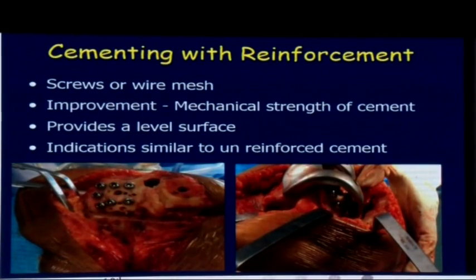You could cement with reinforcement, whether you use screws or a mesh, and you can see what has been done here. Several screw heads have been put to try and incorporate the cement. This is purely a temporary, and I put it to you, this is an emergency procedure because the surgeon hasn't thought about it. He's got caught out and he has to get out of trouble.